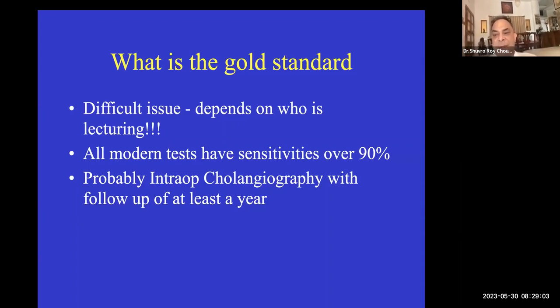If you have a follow-up and the patient did not present with anything to do with biliary stones, then you can say that it is a gold standard. But in today's day, I would say that a combination of MRCP and EUS is the gold standard.